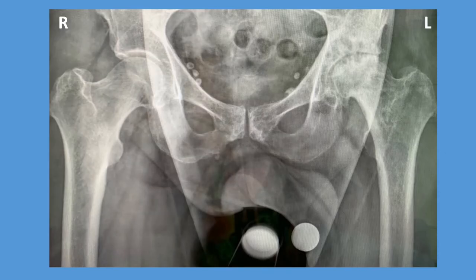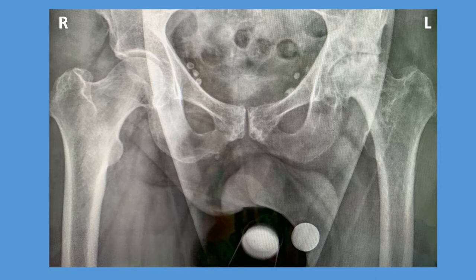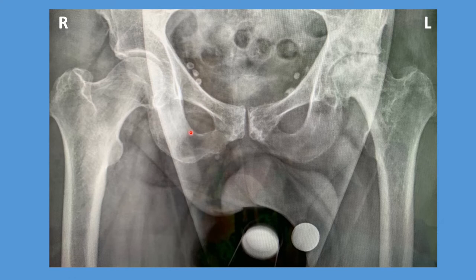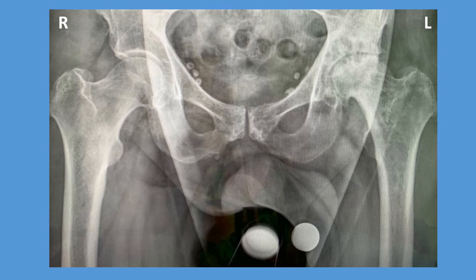Now that this patient is ready for surgery, we begin the surgical planning process. The initial X-rays are very helpful for diagnosis. These next X-rays are critical for pre-surgical planning because we need very pure baseline measurements in order to accurately assess the degree of starting deformity and then calculate what steps are necessary to reproduce a perfect symmetry. We'll first start with pelvic symmetry, looking for balance between the right and left hemipelvis. This X-ray is a good start, but we can see there is still some imbalance in femoral leg position — one leg is in neutral, the other is slightly abducted, and even that slight degree of difference can create abnormalities in measurement. So we're going to reposition the patient until we have an exactly symmetric X-ray.